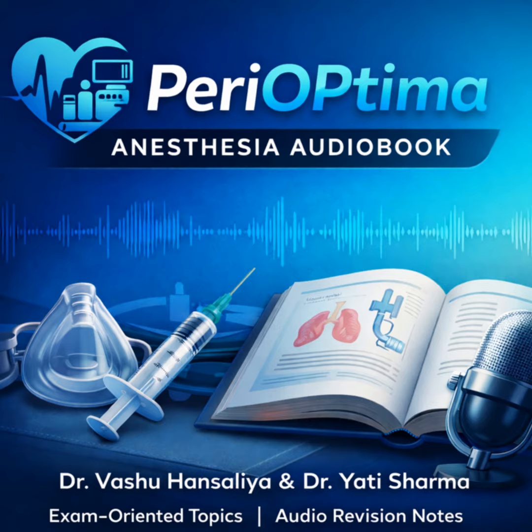Okay, worst case scenario. We've meticulously prepared, but FOI fails. What are the mandatory backup plans? If awake FOI fails, but the patient is still cooperative and breathing, you can try an alternative awake technique. Or if it's not an emergency, you postpone the case. And if it becomes an emergency, if you get to a cannot intubate, cannot ventilate scenario? In that crisis, you need immediate recourse to an invasive airway. That means an emergency surgical cricothyrotomy, or using an intubating LMA as a rescue device. Being ready to transition to an invasive airway is the final safety decision.